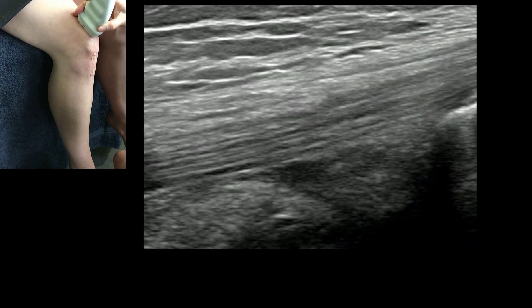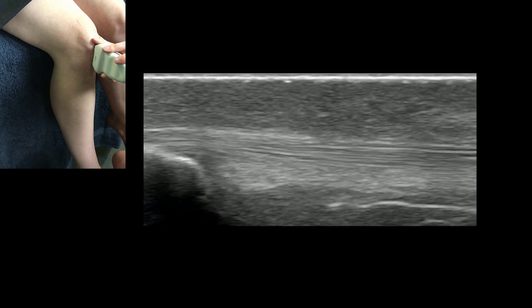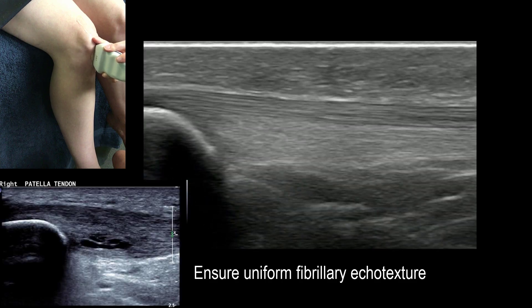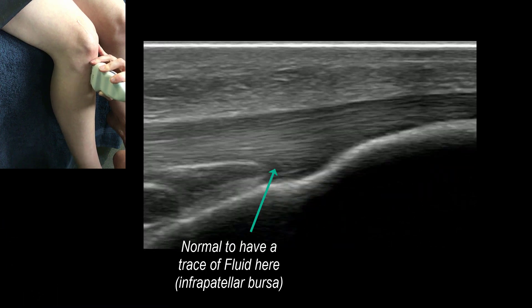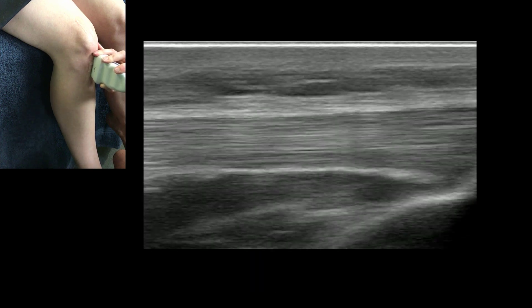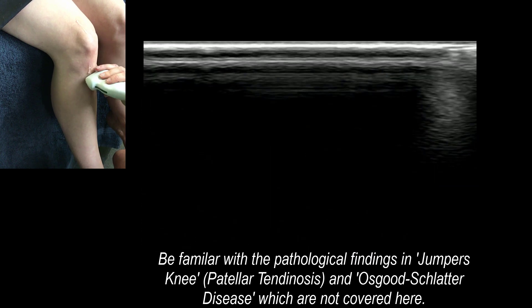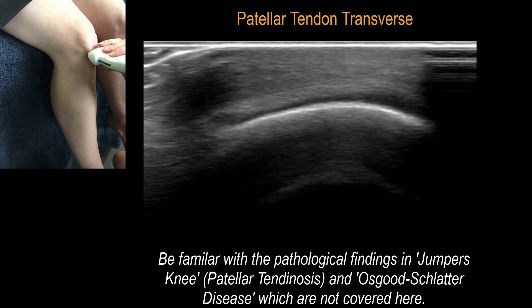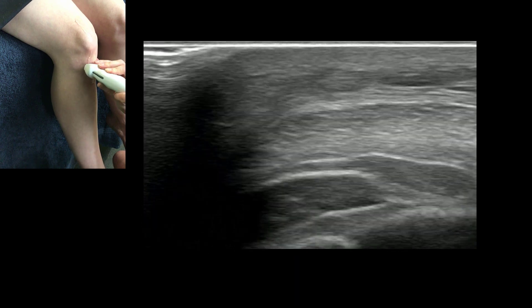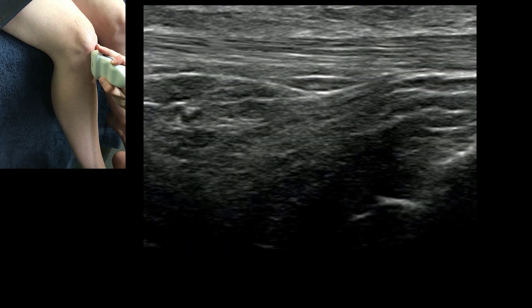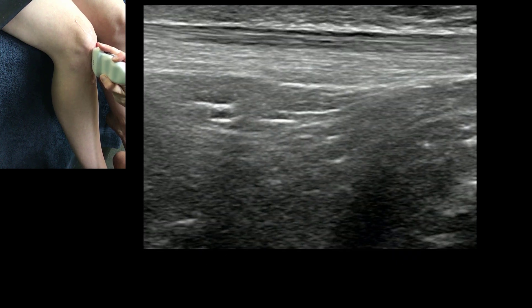After the quadriceps tendon, we move over the patella down onto the patellar tendon. We assess the patellar tendon proximally from medial to lateral, then come down to the tibial tuberosity, assessing medial to lateral. The patellar tendon can be a separate assessment on its own, so we document longitudinal views and a transverse image. With more depth we can look into the anterior knee joint and perform a dynamic assessment.